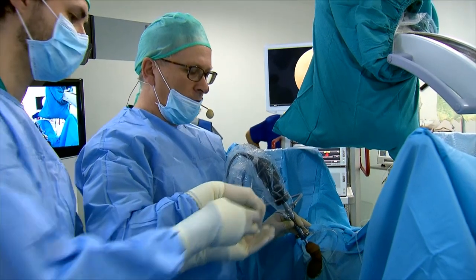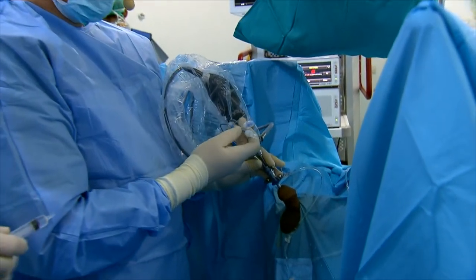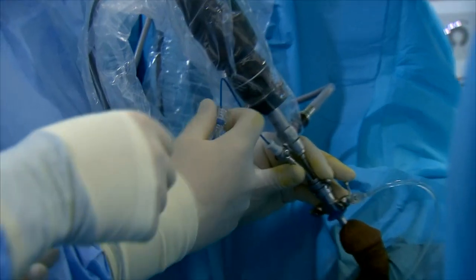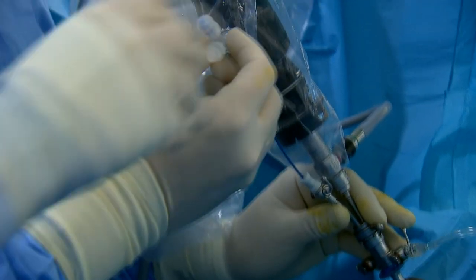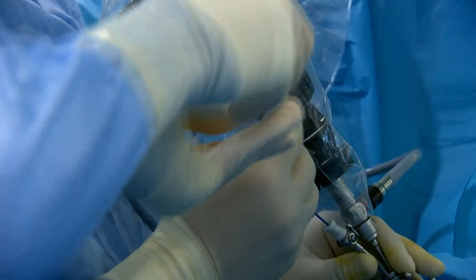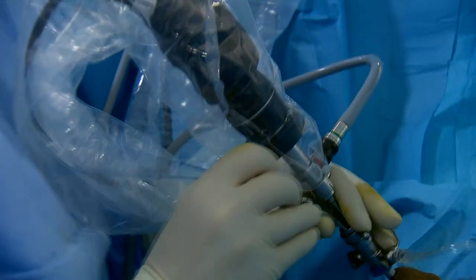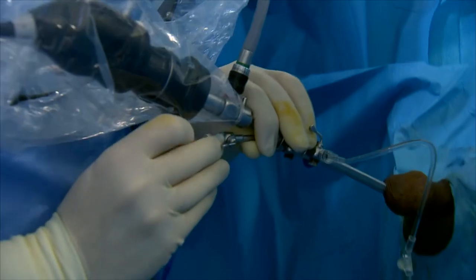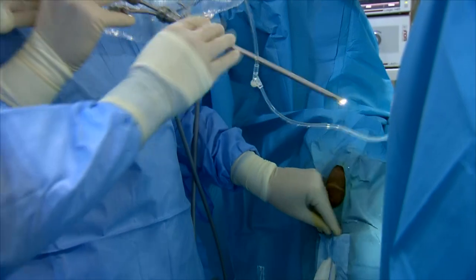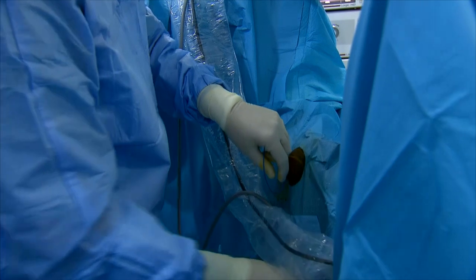We are removing this device in order to take the cystoscope out. We are loosening this screw. We are loosening this screw. Now we can pull it off. Just a moment. It needs a little time. Now we are going to remove the cystoscope. And now we reposition this special device.